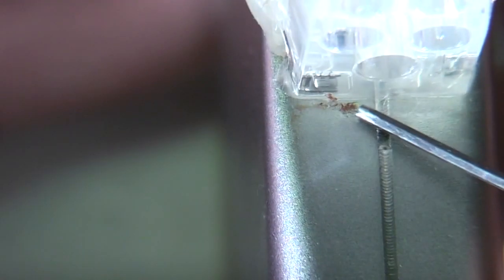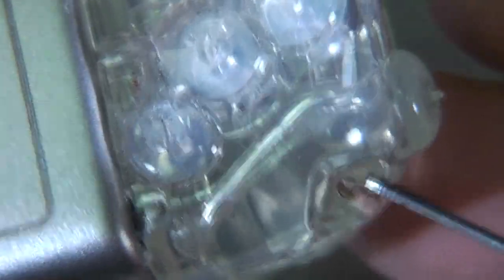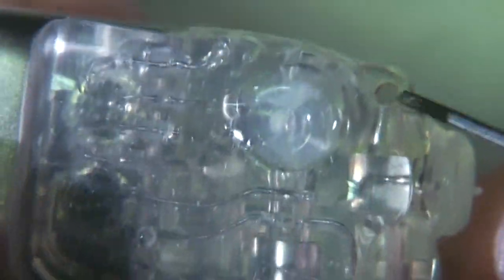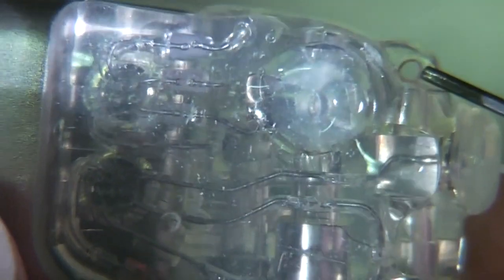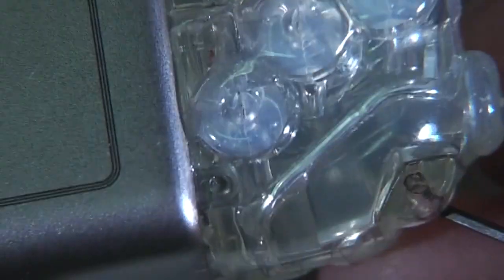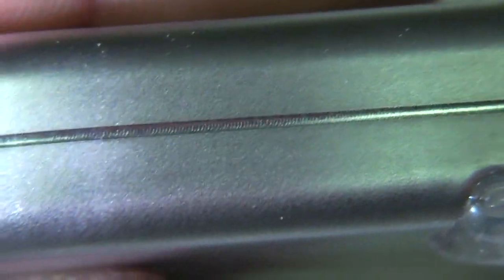This one does actually show evidence that it may have had a previous owner. There's some remnants of some sort of biological goo in there. I'm guessing this hole is maybe for attachment. Maybe they cable tie it into the rib cage or something. I don't know. Doubt if they want it just slopping about. So I'd imagine there's some attachment. So I think we need to get the Dremel out to crack this thing open.